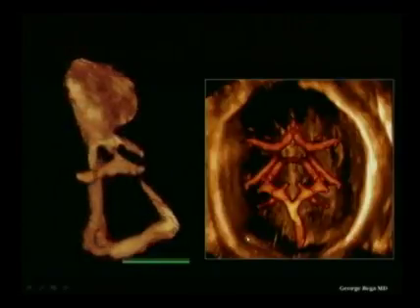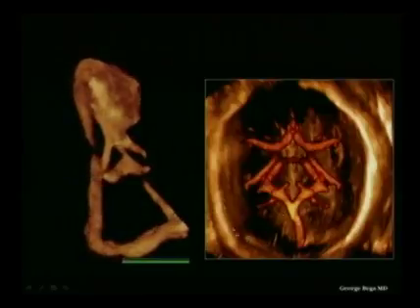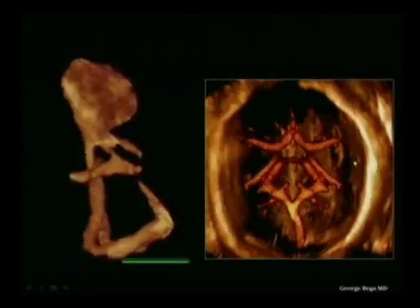This is the circle of Willis, acquired with a 3D probe. This is acquired with a transvaginal probe in a head-down fetus. Here in this slide, you have a number of technologies offered by 3D ultrasound that can visualize the cardiovascular system. Now, here we have both Doppler and non-Doppler based technologies to visualize the cardiovascular system. In A, we have a volume acquired with a normal single 3D volume, and the rendering is minimum intensity projection.